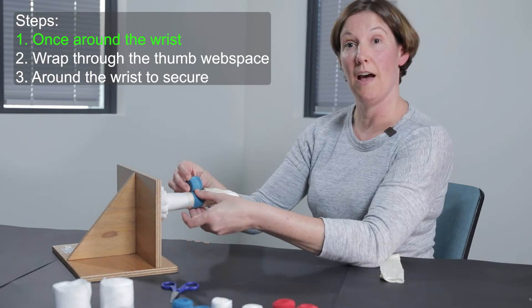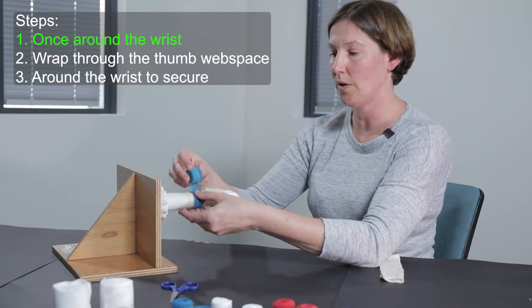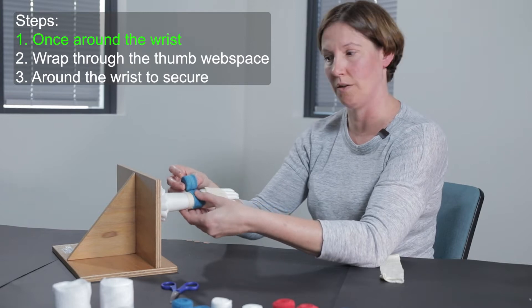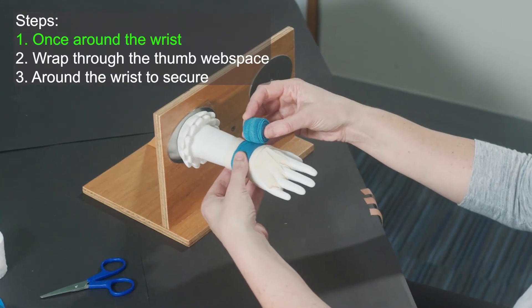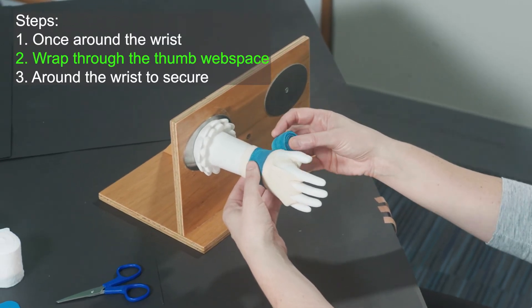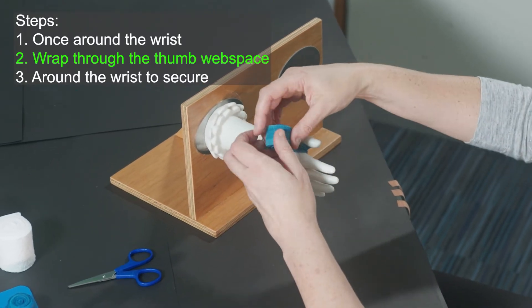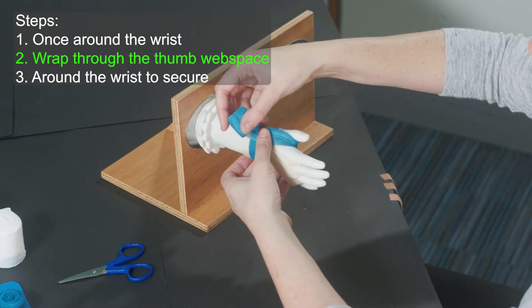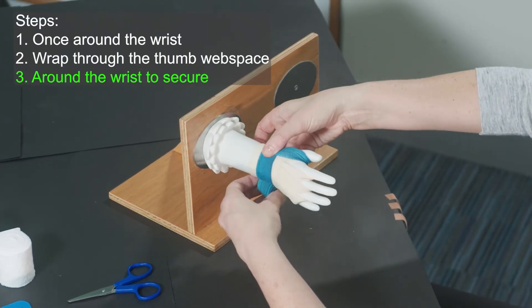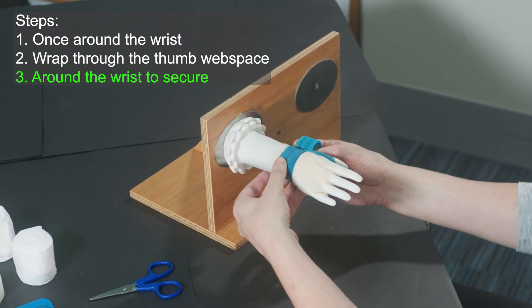Be very conscious of how much tension you're putting on the bandage — some bandages are quite stretchy. We want to just be laying them down very gently and not really pulling and forcing the bandage into a particular direction. Once we've put one layer around the wrist, we're going to start by wrapping the thumb. Come into the palm first, bring that down, and go right around that thumb. Then go around the wrist again — always wrapping towards the little finger — and that secures our thumb wrap.